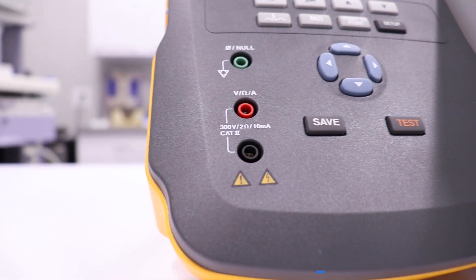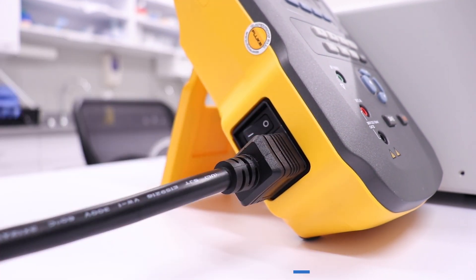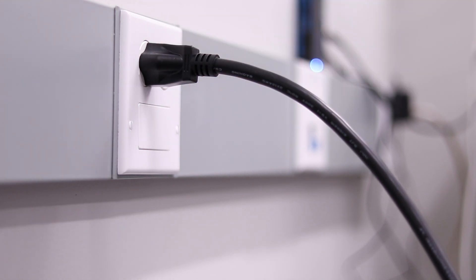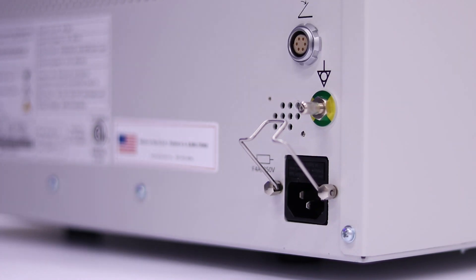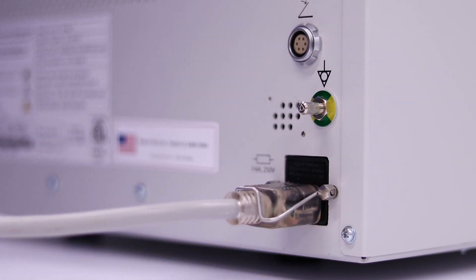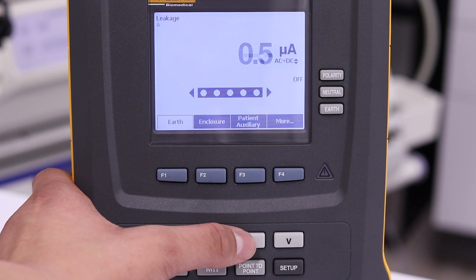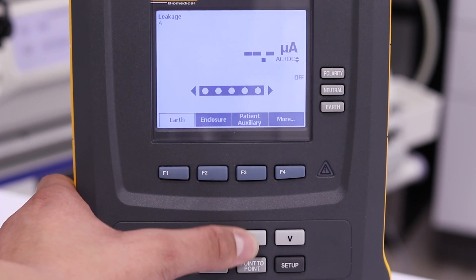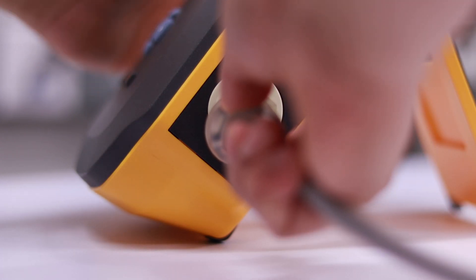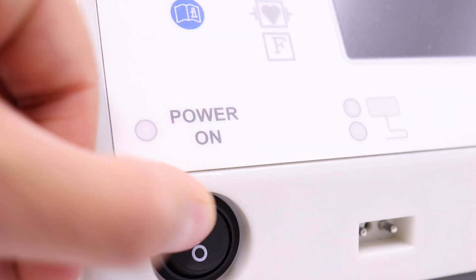We begin this test by plugging the AC power cord into the ESA. Plug the ESA into a wall source. Plug the AC power cord into the GI-4000. Power on the ESA. Press the A button on the ESA to allow the device to power its test subject. Plug the GI-4000 into the ESA. Power on the GI-4000.